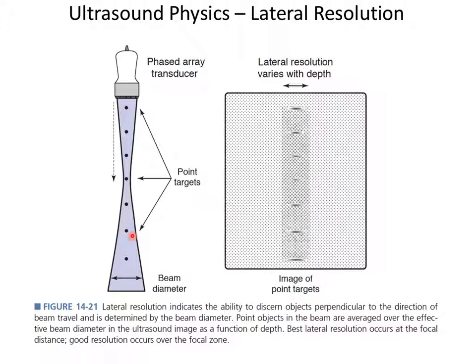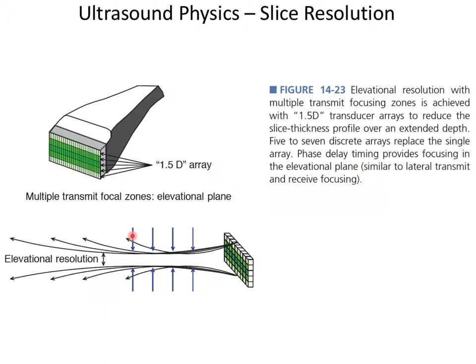But the issue with ultrasound is everything's moving. In cardiac ultrasound, everything's moving all the time, right? The transducer is moving because the tech is moving it in their hand, the heart is moving, there's breathing. So you usually deal with it.